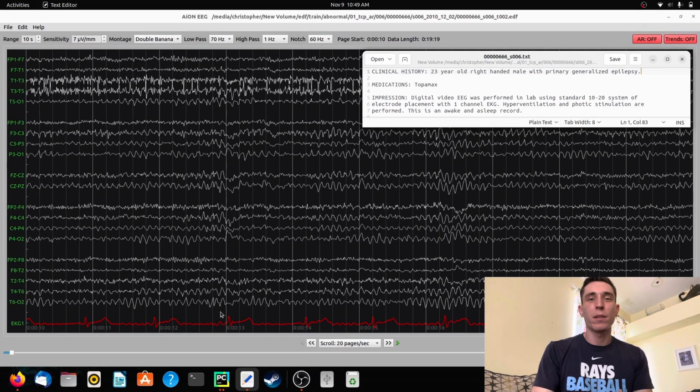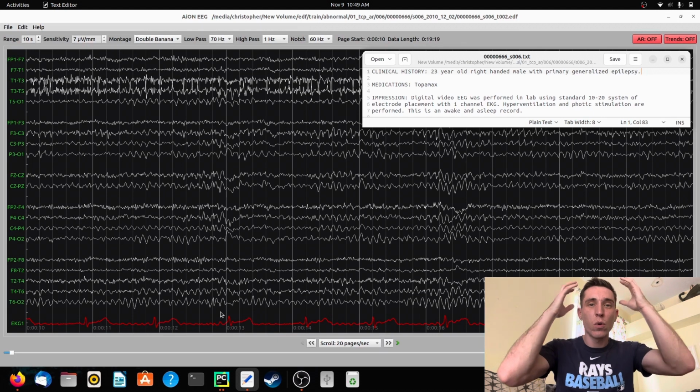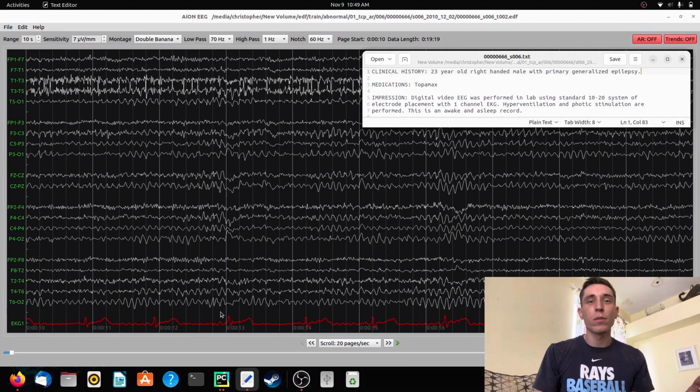My name is Beckwith, and in today's video we're going to be looking at an EEG of a 23-year-old right-handed male with primary generalized epilepsy. Now if you're unfamiliar with EEG, generalized means that it affects the whole brain compared to focal, meaning it just affects one specific focal part of the brain.